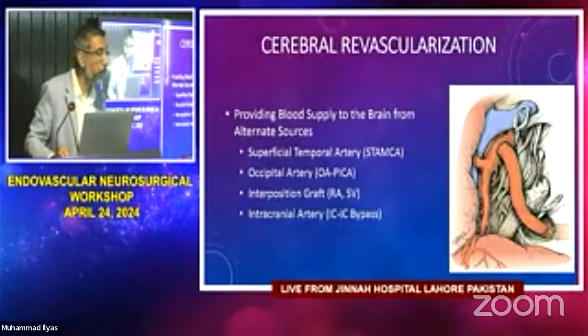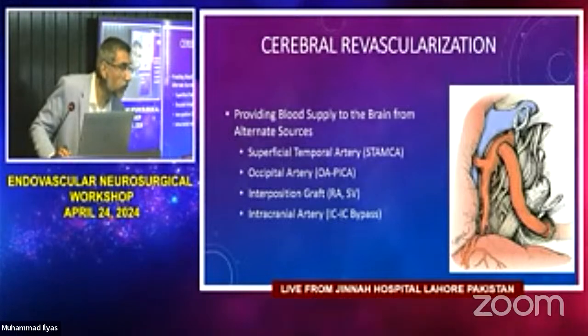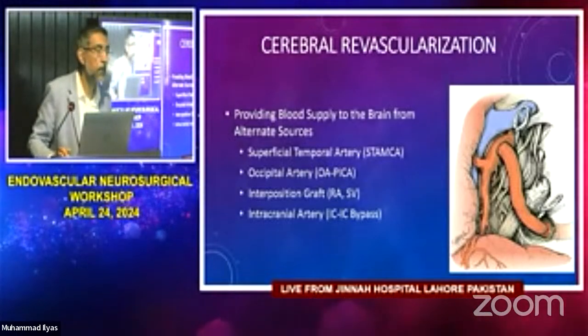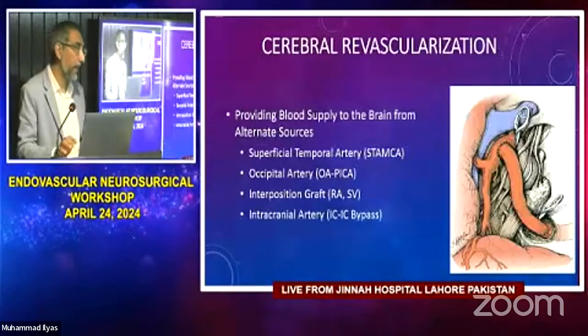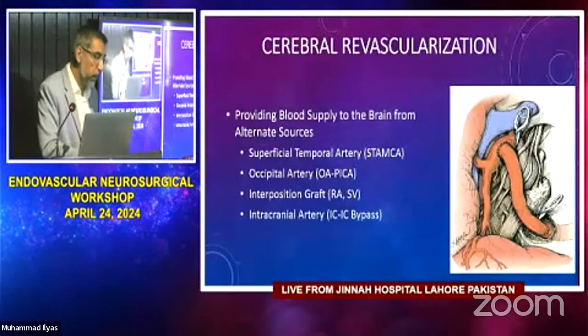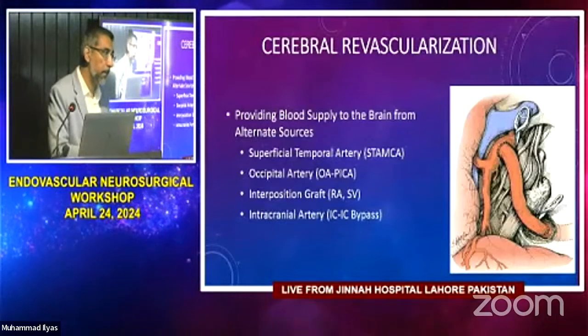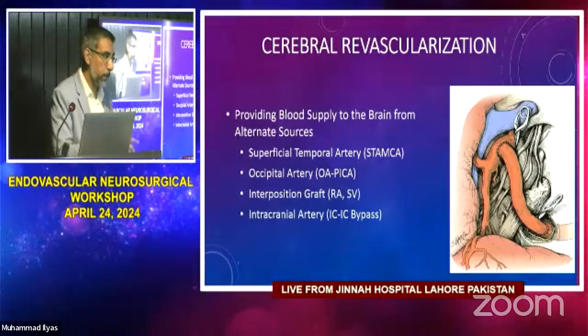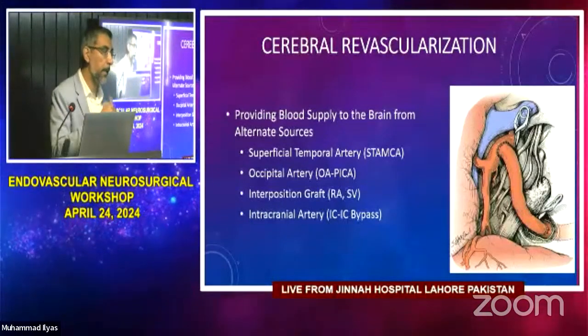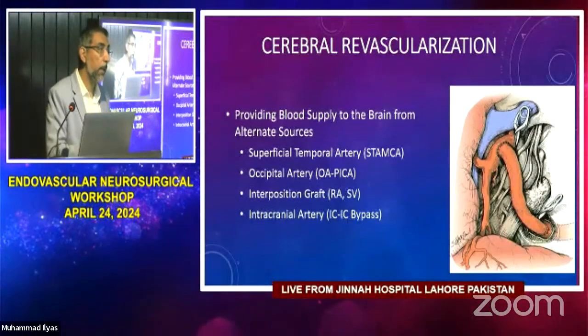This device is now being used for CCF management, but it's not approved for it. It's an off-label use. The only approval right now is for cardiac people for coronary perforations, because they apparently get perforations all the time, especially if it's a really hard plaque and whatnot. And we're working towards getting it approved.